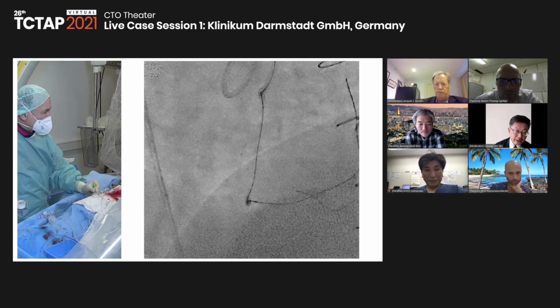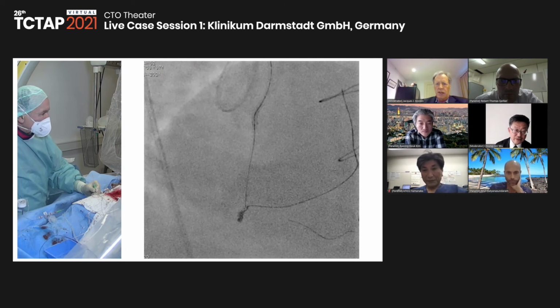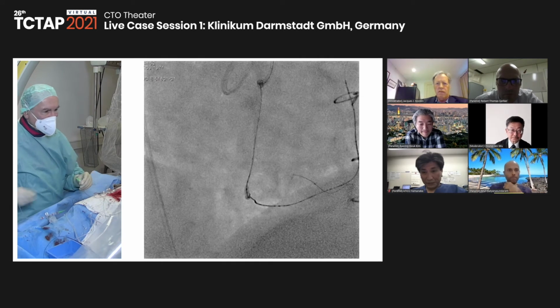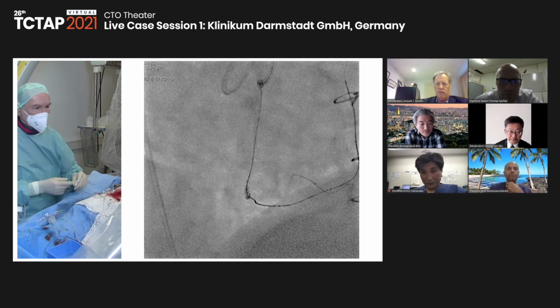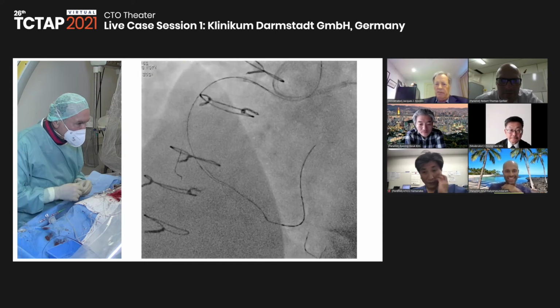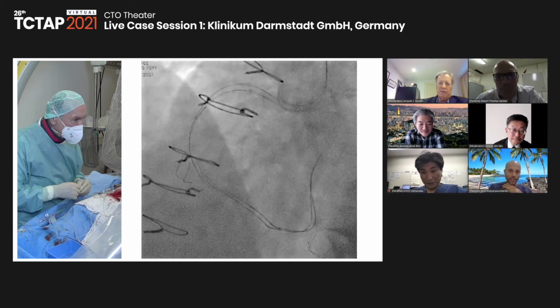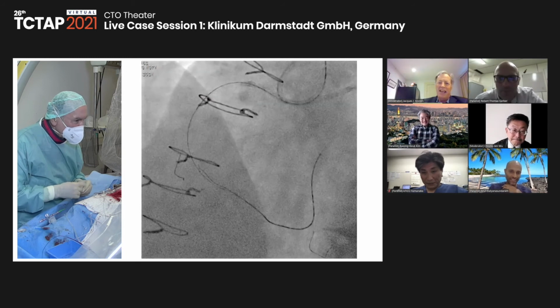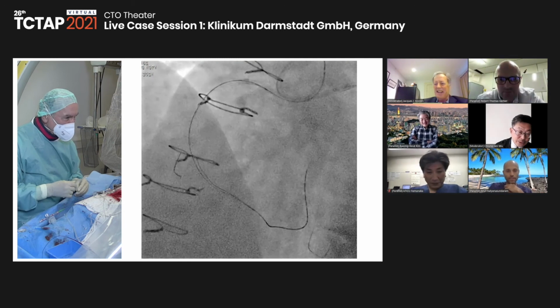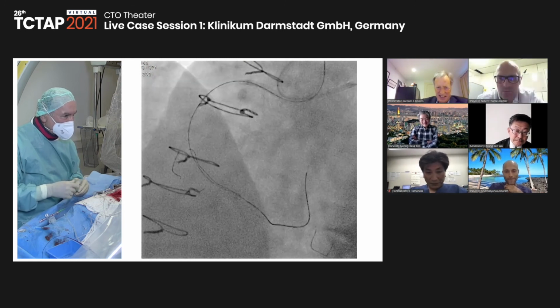Beautiful. From the aerial view, it seems quite close to the antegrade. Yeah. So we are definitely in the same space. So this is just a matter of patience and progress. Yeah. We missed the audience for the applause. Yeah, you have the zoom button. Okay. There's a zoom option for applause. Okay. So we are proximal. Yeah.